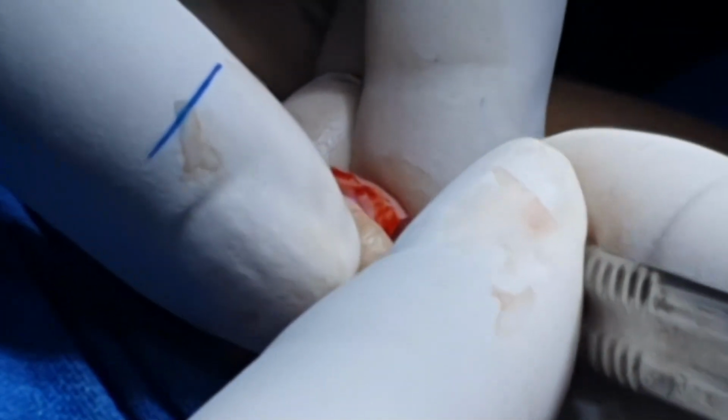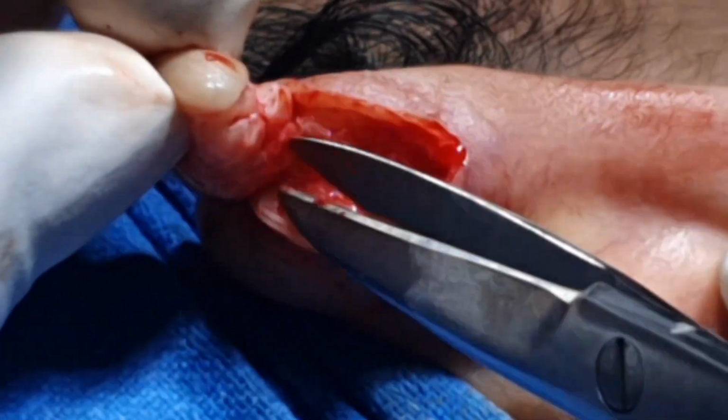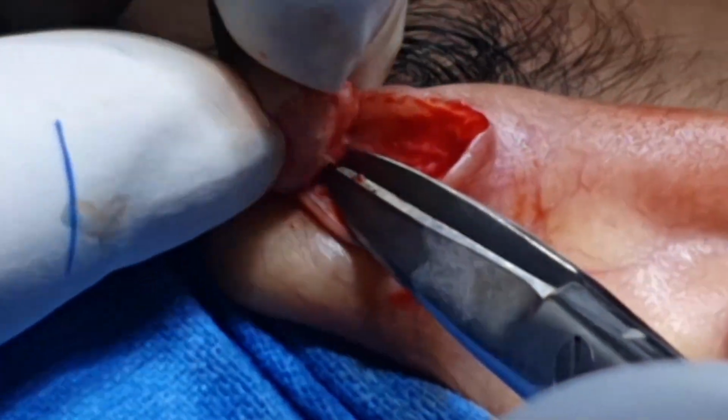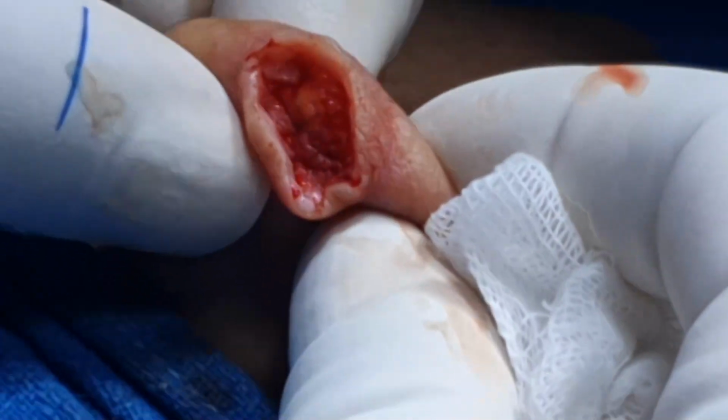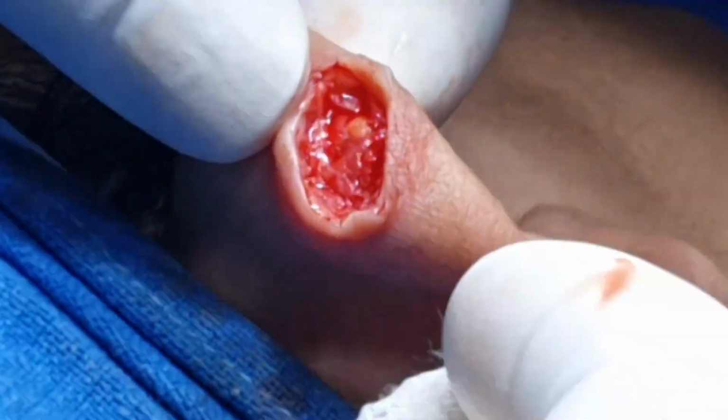It is still there, so we will core out from here also. Avascular field, we have preserved the pinna. Now we will core out this portion.